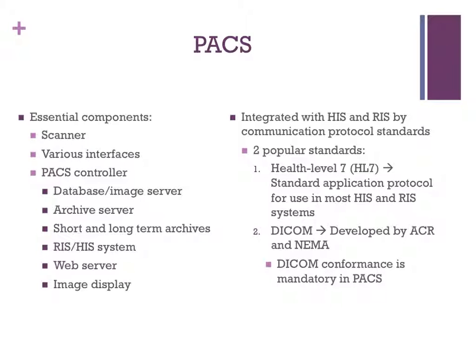There are two popular standards, and the first one that we'll discuss is Health Level 7, referred to as HL7. I'm sure you've heard of this before. It is the standard application protocol for use in most HIS and RIS systems. And then there is DICOM, and this standard was developed by the American College of Radiology and NEMA, which stands for the National Electrical Manufacturers Association. DICOM conformance is absolutely mandatory when dealing with a PACS.